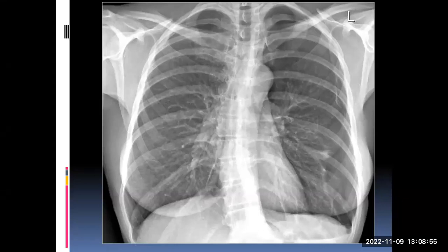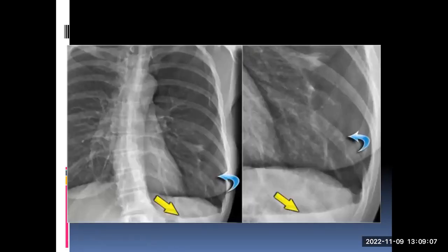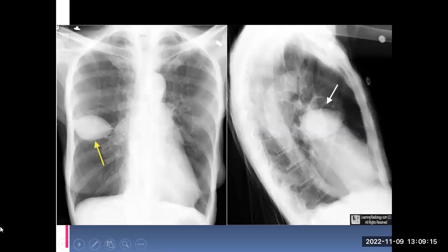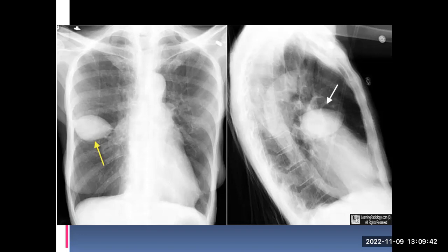In this case of hydropneumothorax you will see the lung edge. If you look carefully you can see the lung edge. Vanishing tumours: sometimes when patients have fluid in the pleural space, fluid can get entrapped in the fissures because the fissures are in continuity with the peripheral pleural surface. This is called the vanishing tumour — you see it one day and not the next. It looks like a mass but on the lateral film you see it is fluid entrapped in the horizontal fissure. Likewise, fluid can get entrapped in the oblique fissure. It can drain by itself, so the next day you might not see it.